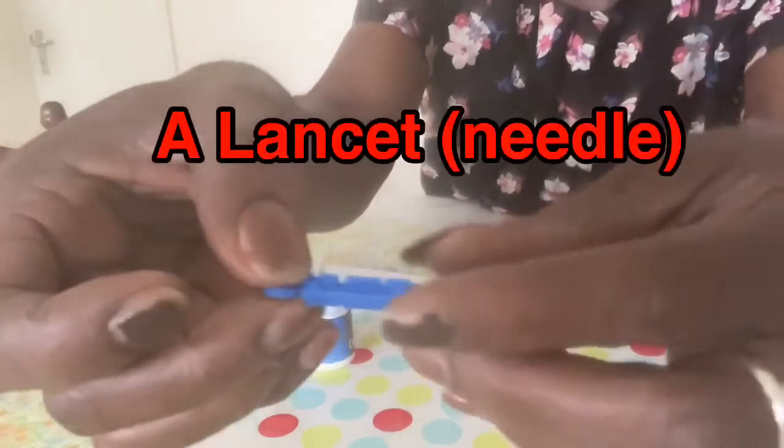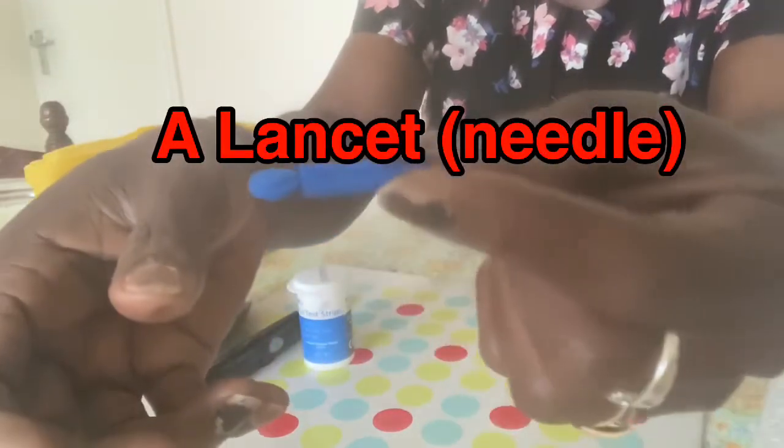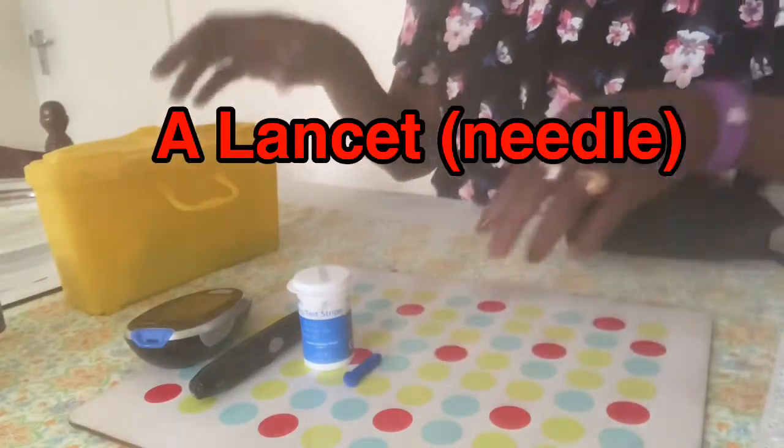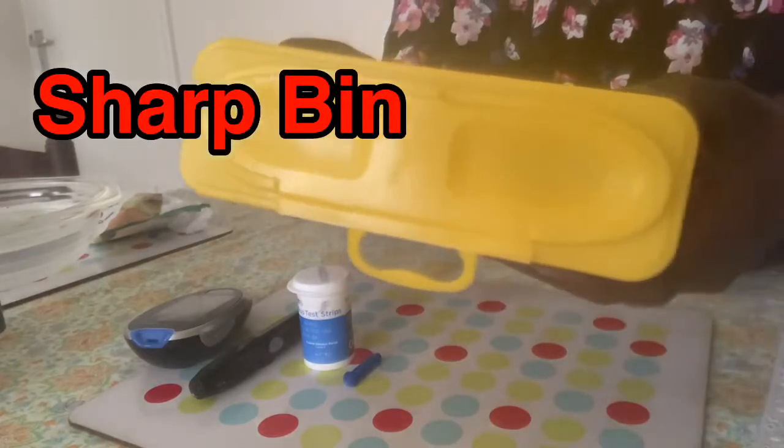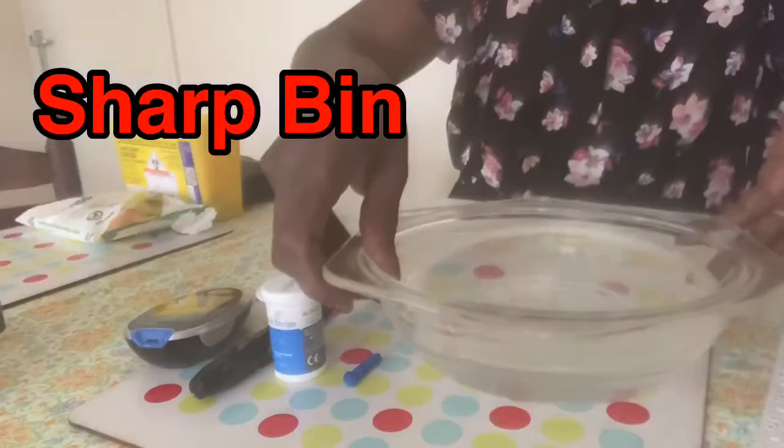which is a very short, fine needle. And a sharps bin to dispose of the used needle and strips.